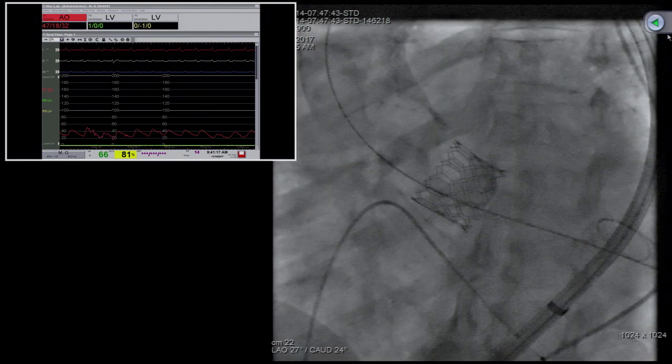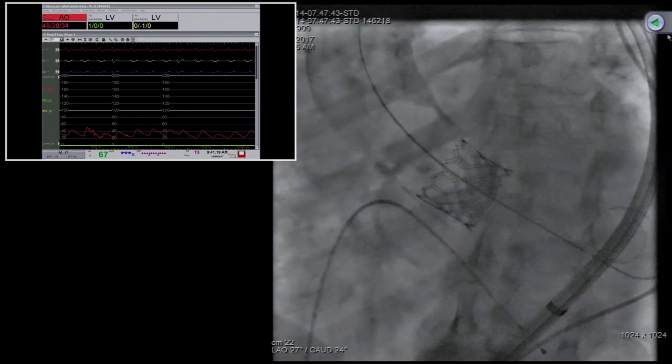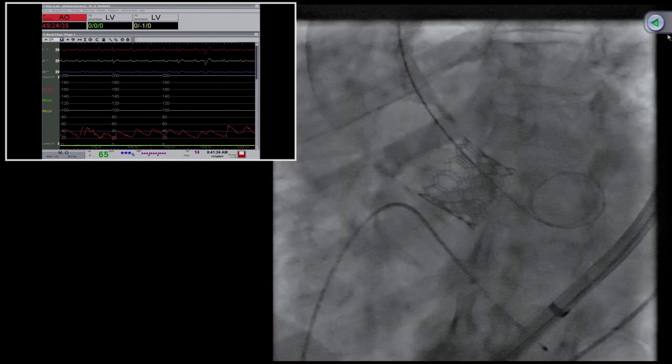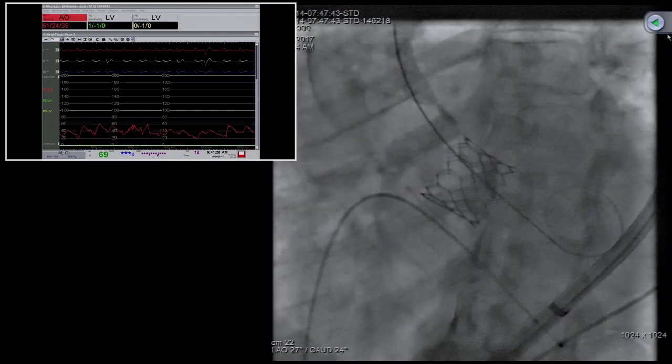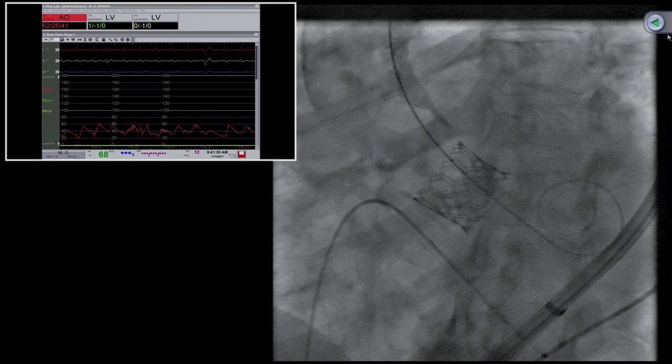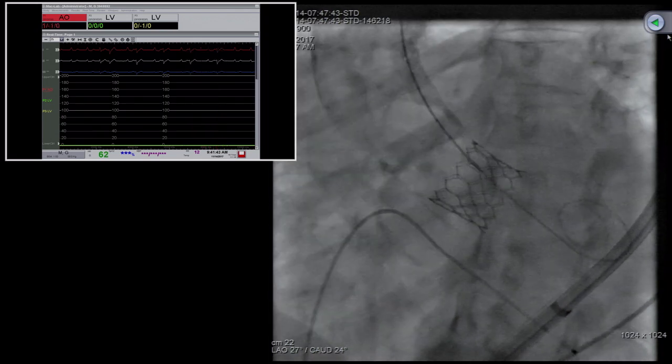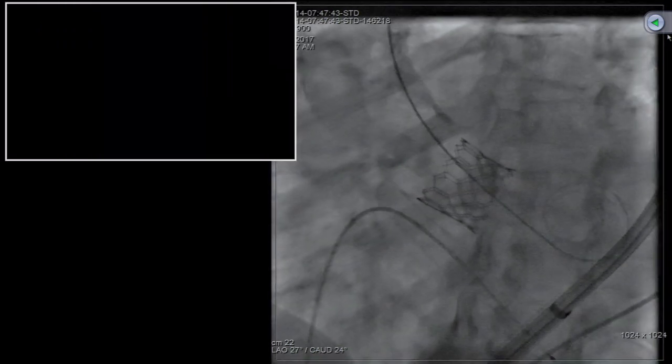And we can take echo also. I think you do not need it yet. Not yet. Wait. You need the wire. Let the blood pressure come up. The wire won't move. Looks good. You can take a little pigtail and take out the equipment. Show us the echo now, a little closer here. Tell us now, because we don't want it later. We want it now. Okay, move it. Fine, but I need access.